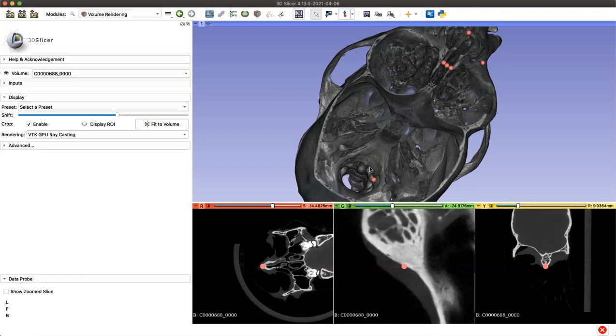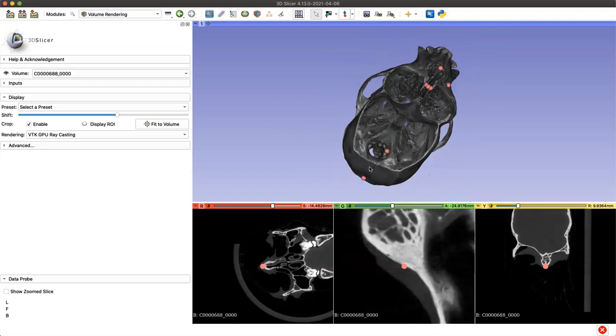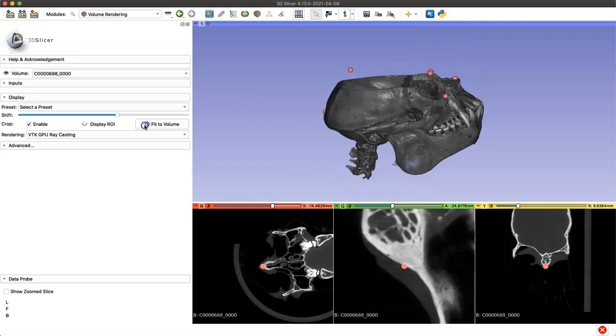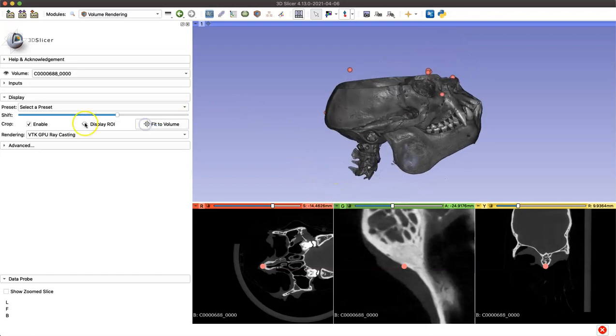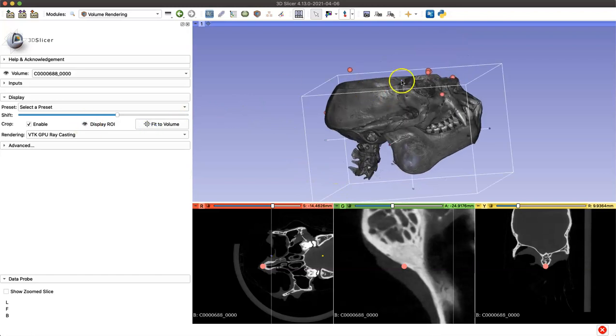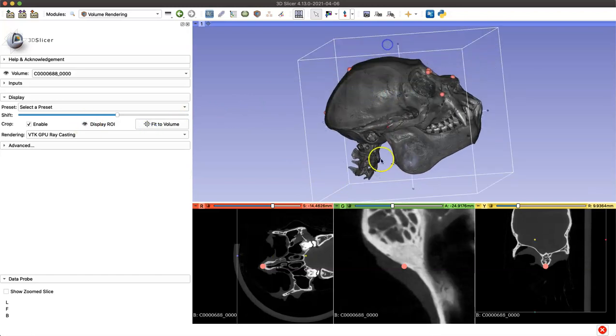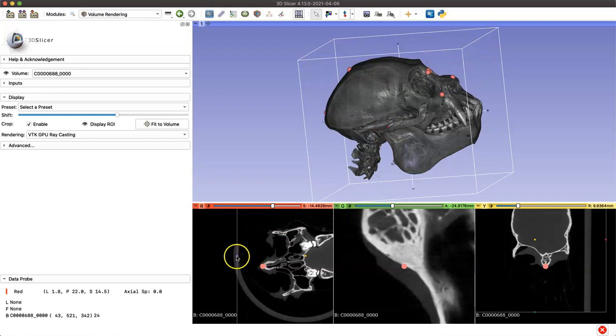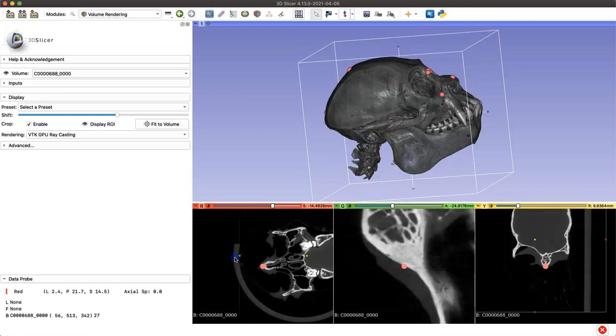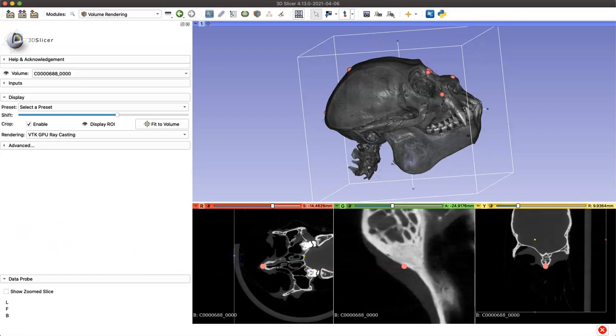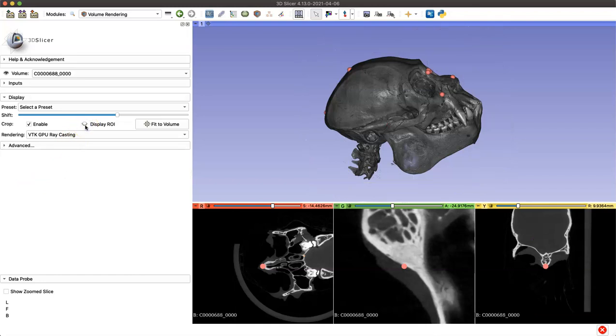You can also do this in 2D space in your slices below. If your ROI box is turned on, then you can adjust it in the slices below as well. The last tip I'm going to show you today before we learn how to save our landmarks is in the markups module. I'm going to turn off my display ROI and navigate there.